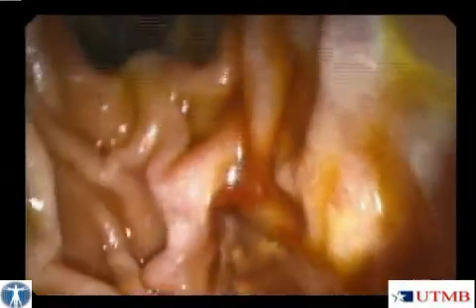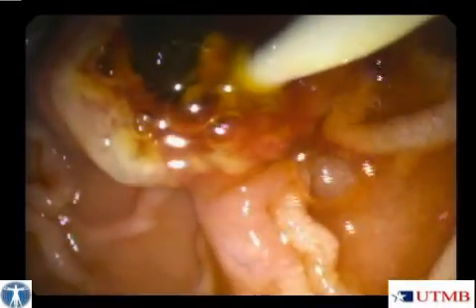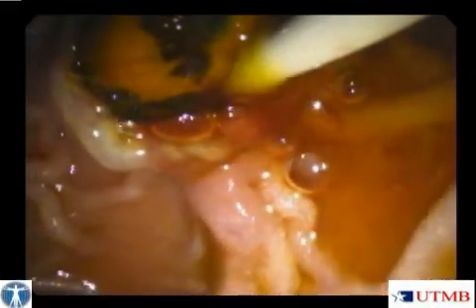After slowly deflating the balloon, it was removed from the ampullary orifice. Here you can see the dark stone at the orifice. Finally, using a balloon sweep, the large common bile duct stone was gently extracted as if to deliver a baby.